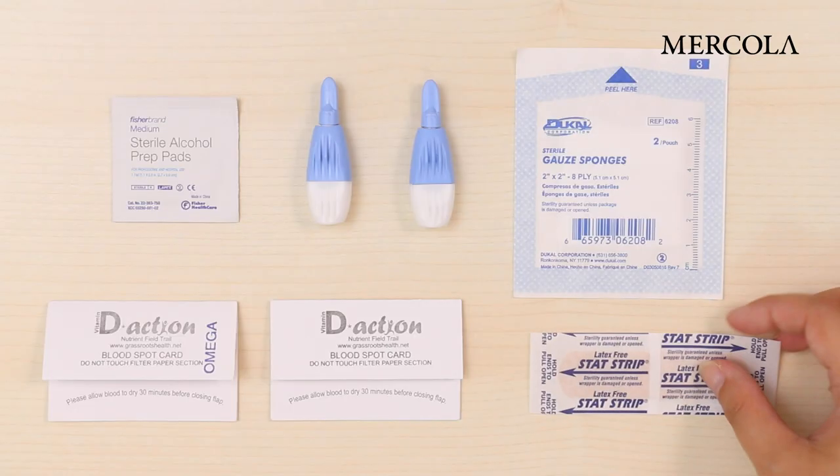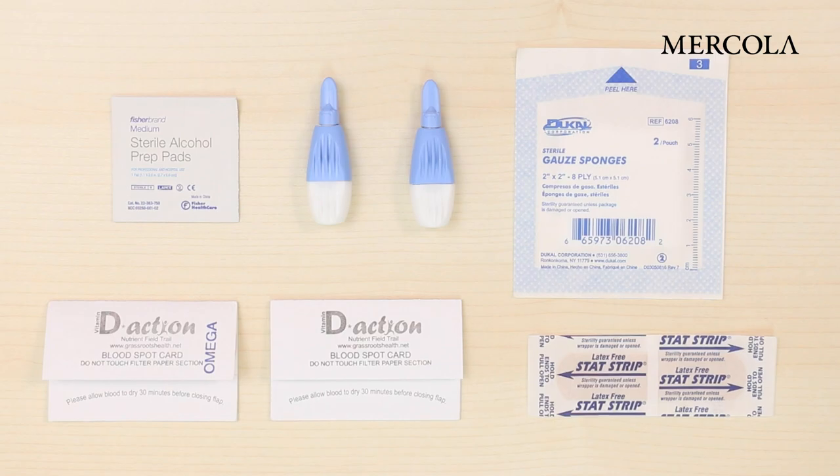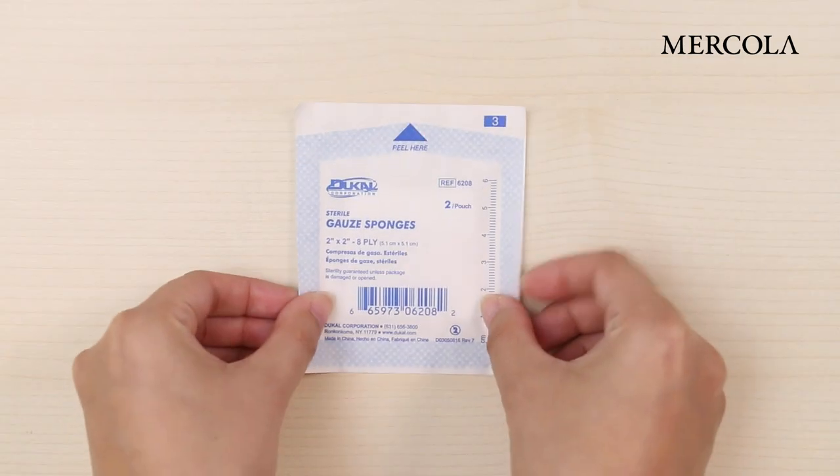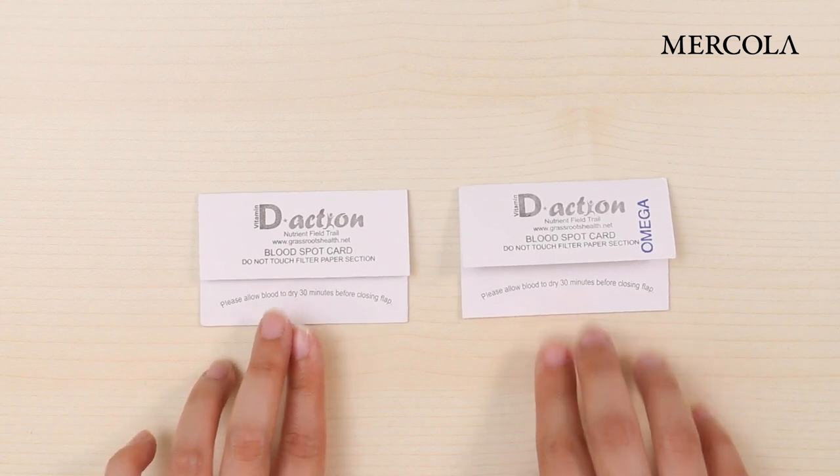The first thing you need to do is to lay out all the pieces in this order: alcohol pad, lancets, gauze, blood spot cards, and bandage.